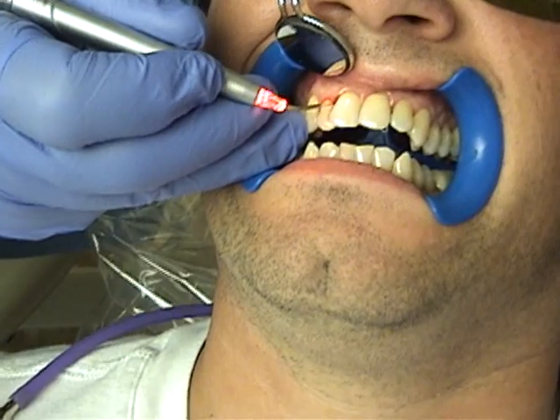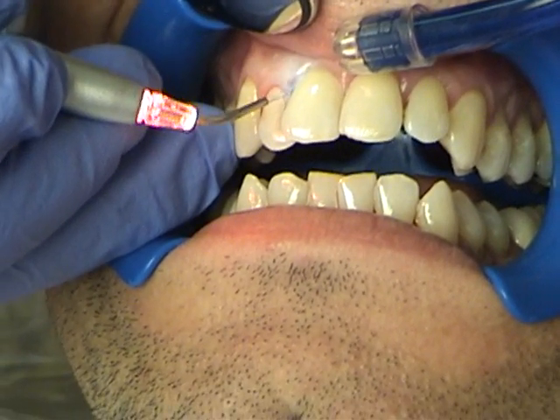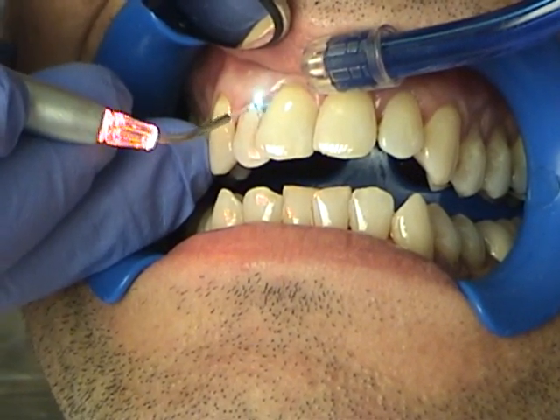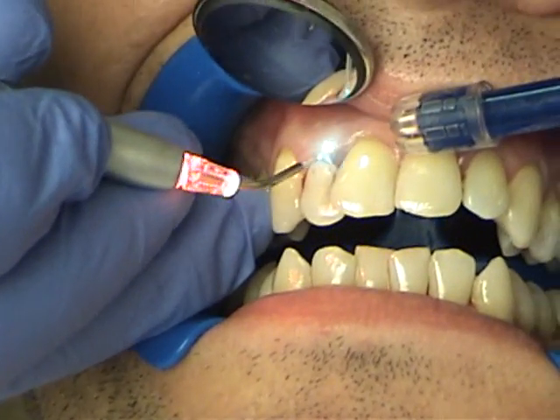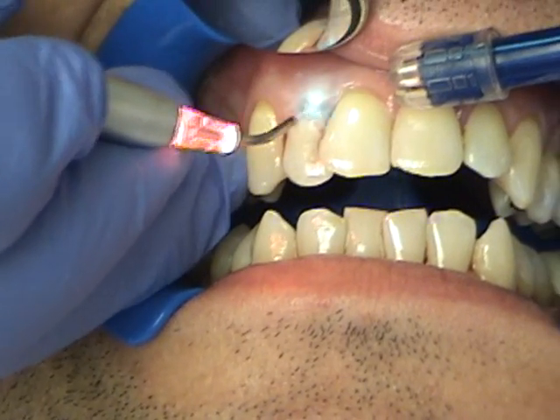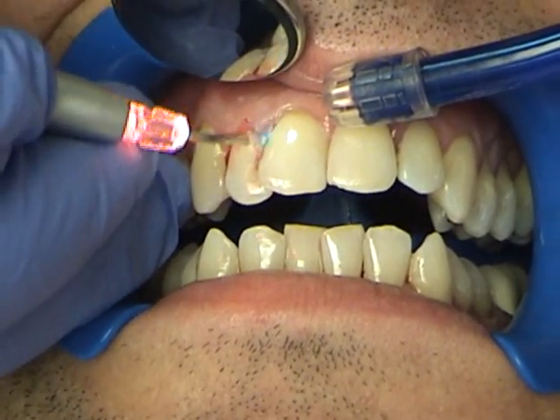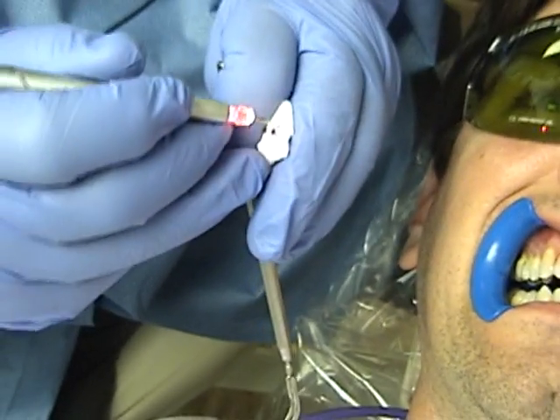Then we're going to do the other side of the pocket — put it to the depth of the pocket and withdraw. This is the 400 micron, seven millimeter long tip. You can see how the diseased epithelial lining just bunches up like a little ball at the end of the tip. We have fairly good hemostasis as well, and the patient is comfortable — he's not jumping out of the chair. We clean with dry gauze, running it through.